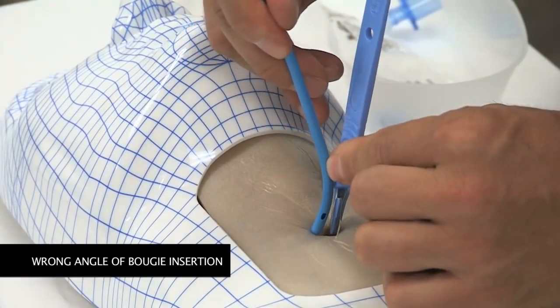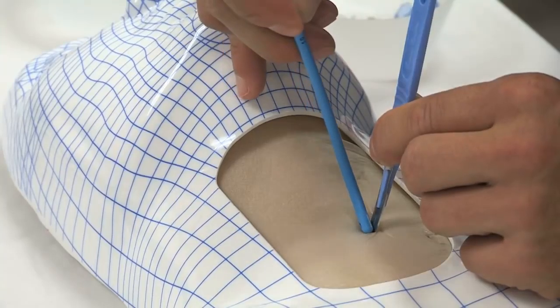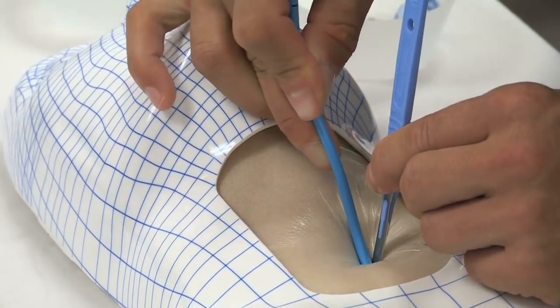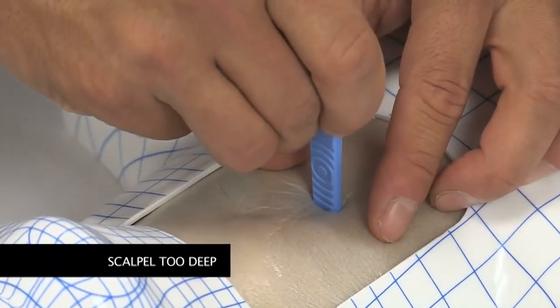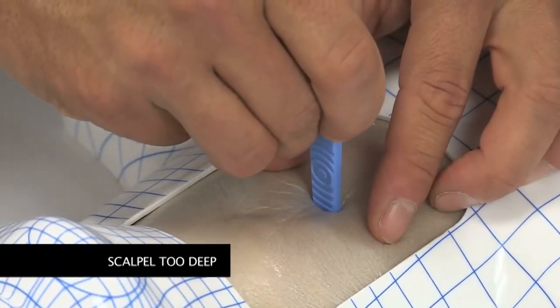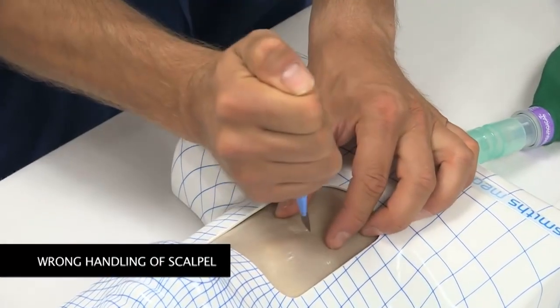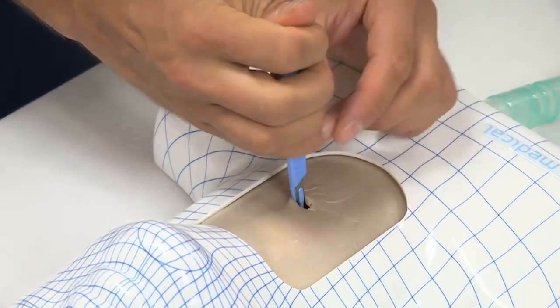Bougie insertion, other than in the horizontal fashion with the tip touching the scalpel blade, can make the bougie tip go into a paratracheal plane and may result in paratracheal insertion of the bougie. Too deep insertion of the scalpel blade may result in tracheal back wall injury. Too much force while performing a stab incision may result in excessive damage to the airway. This may cause excessive bleeding or even result in tracheal transection.